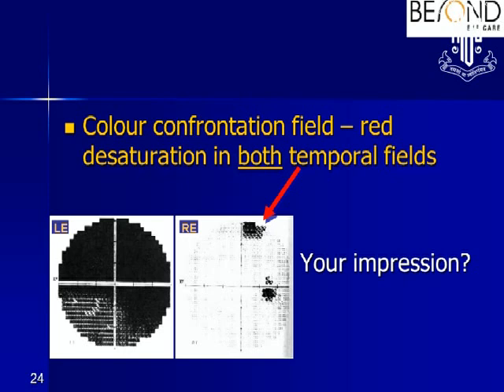What do you think about the left eye? Left eye is profound visual impairment, and there is absolutely nothing in the central visual field. Right eye glaucoma? Okay, so what are the types of junctional scotoma? Do you know who gave the name junctional scotoma?